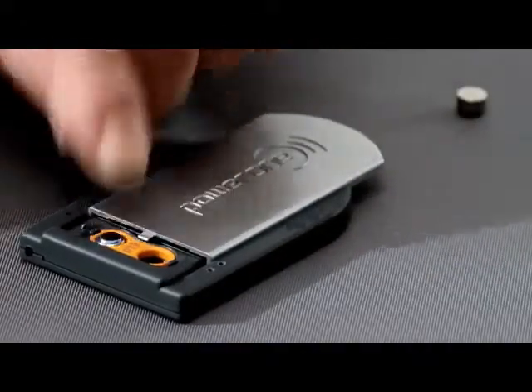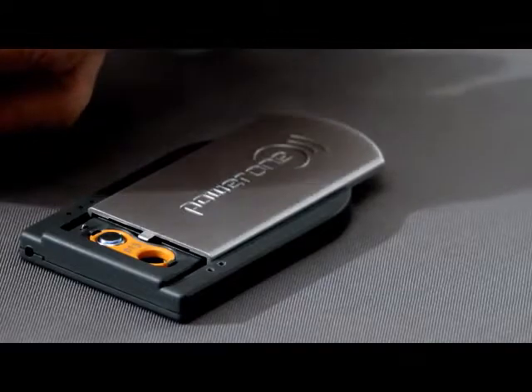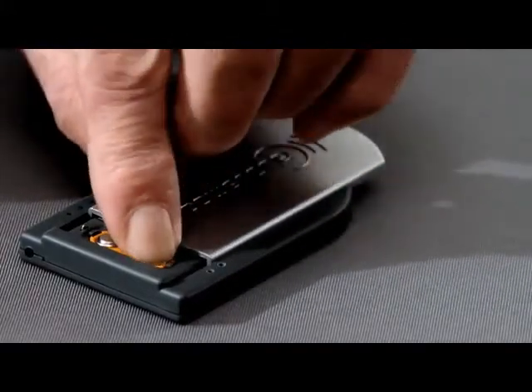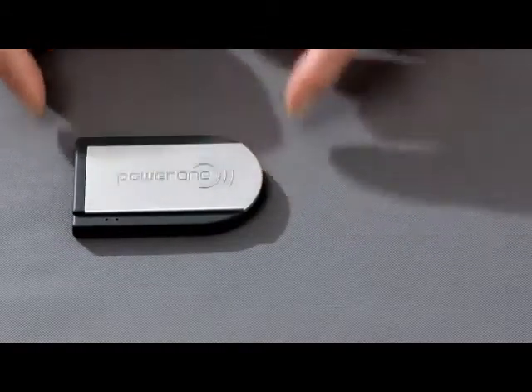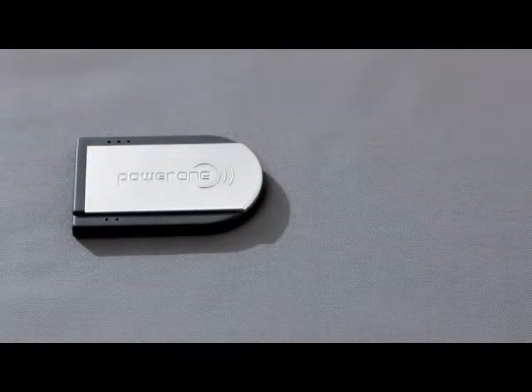The battery side with a blue ring should face upwards. Charging takes two and a half hours. The charger light will flash green every four seconds and go out once the batteries are fully charged.